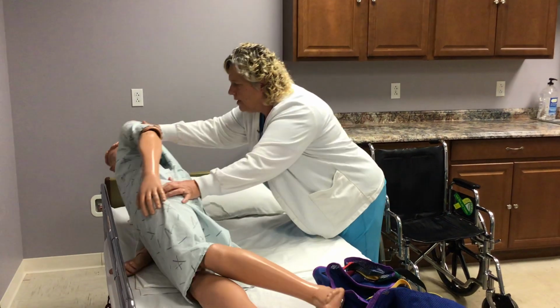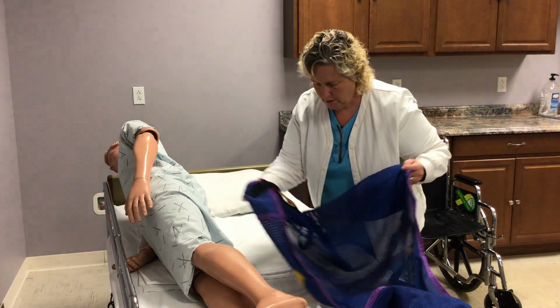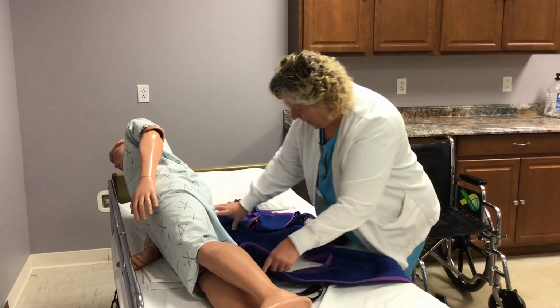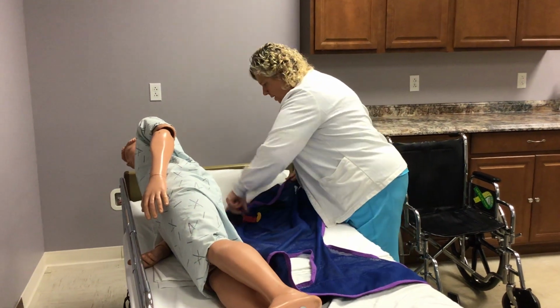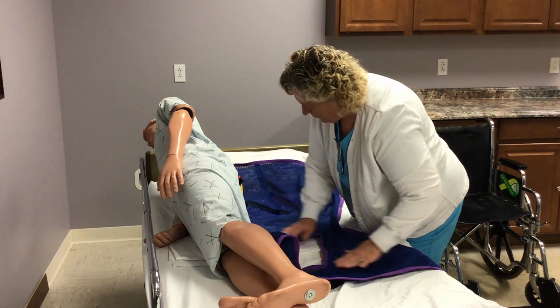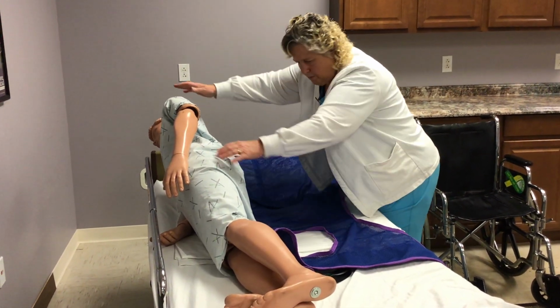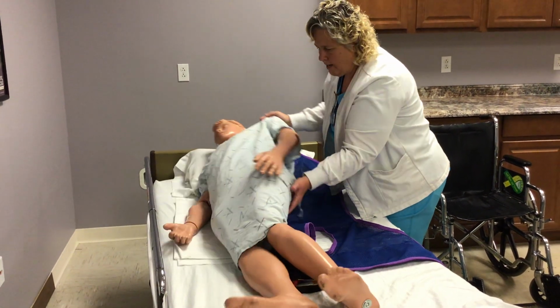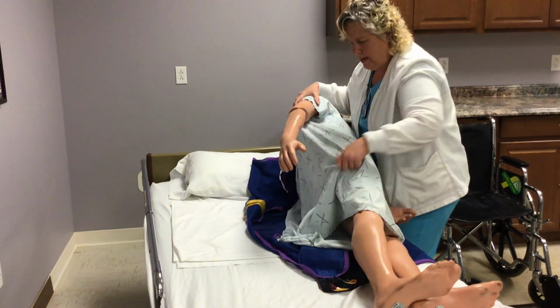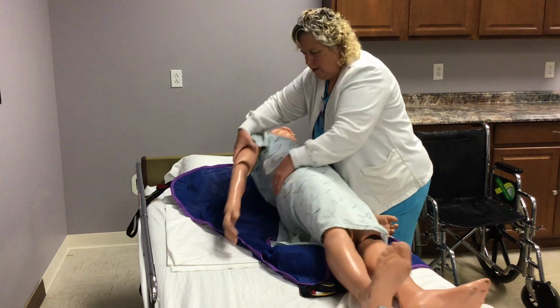Turn them. Lay them up towards the side of the bed, and then take your sling and lay it out, half to you and half to them. And you want to try to get it at the base of their neck, and then however far it goes down. And then we shoulder and hip. I lay her back down, shoulder and hip, roll her to me, and just kind of make sure that I've got it in a nice situation.